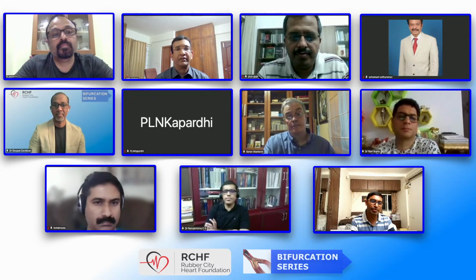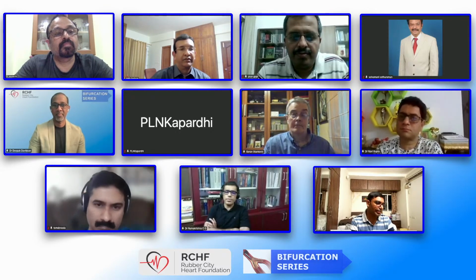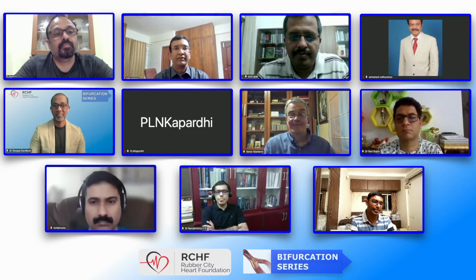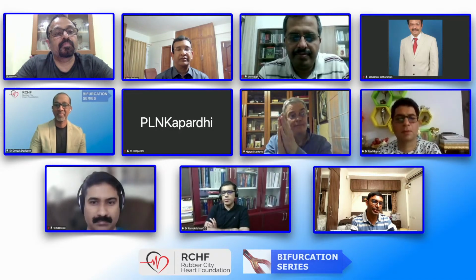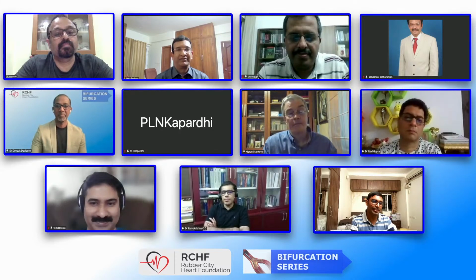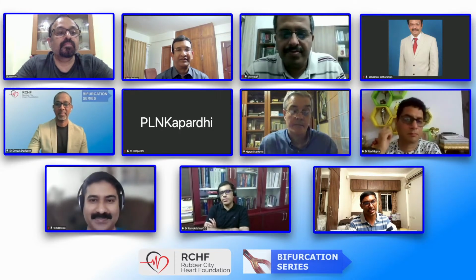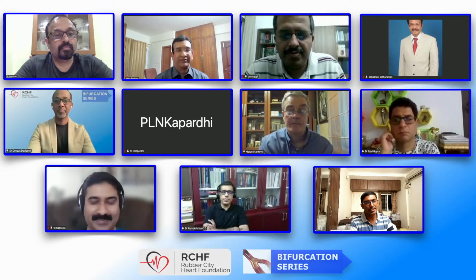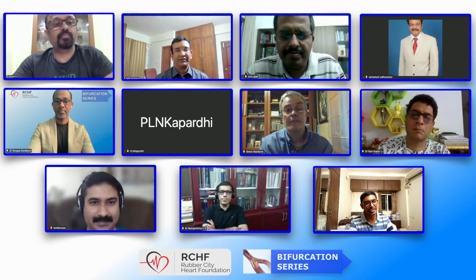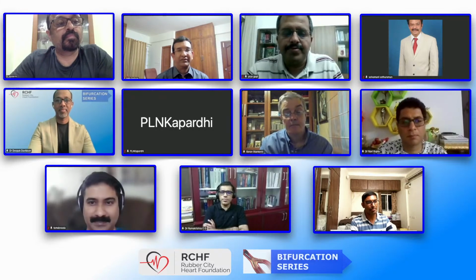It is again personal preference. I think Dr. Goran insists at every meeting that the stent strategy is not important. What you get in the end matters, if it is an optimal result, whatever stent strategy you do. I think that is ultimately the thing that we have to realize. Even if you say that double kiss crush is good, if you don't do it optimally, I don't think you end up with good outcomes.